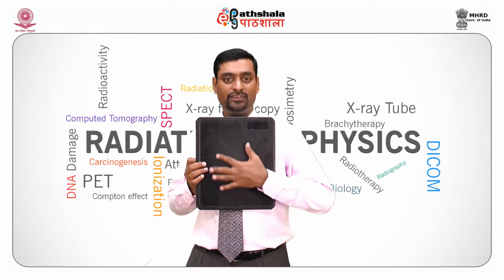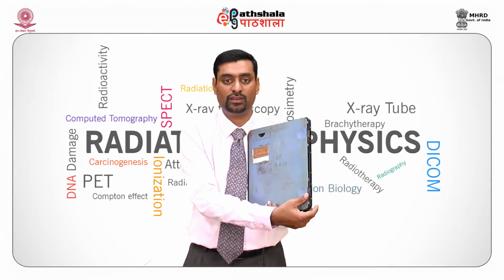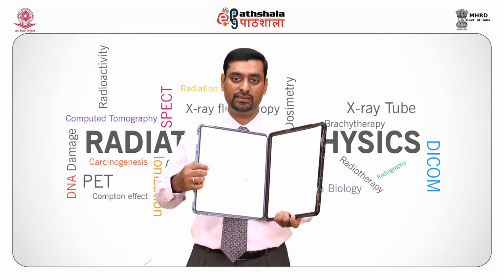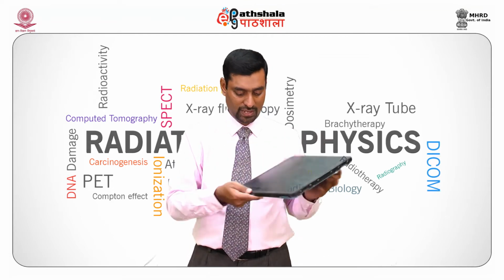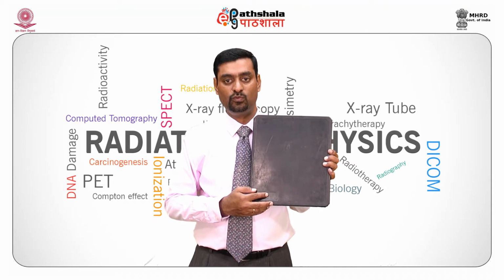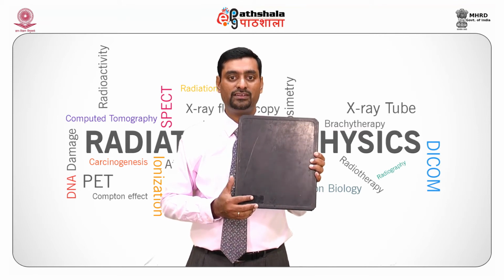This is the front side of the cassette. This is the back side of the cassette. The cassette has hinges so that you can close it, and inside the cassette is the intensifying screen. There is also a place for a small identification mark, where the patient identity is found. So this is about a small film screen cassette.